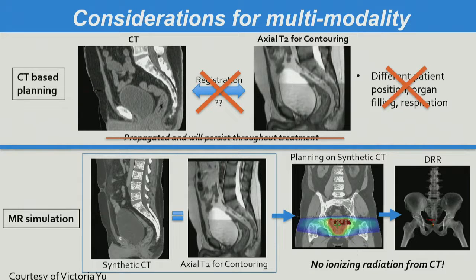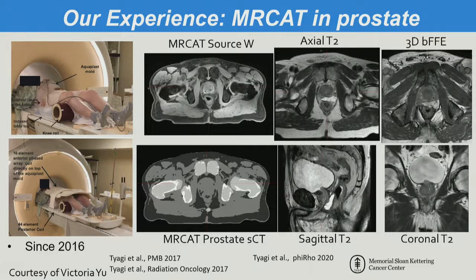So some considerations: we can also use multimodality. For example, and apologies, this slide was two slides, and when putting it here, I deleted the one without all the crosses. Sometimes we use our planning CT in combination with other images, like MR, where we can better see, for example, the target. And then we pass that information from the MR to the CT.